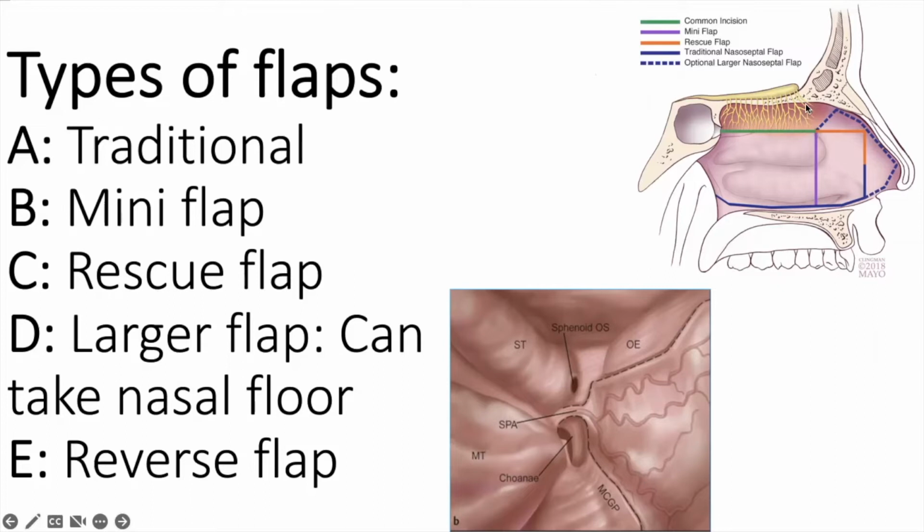And once these olfactory fibers end at the anterior limit of the middle turbinate, then your cut can go to the most superior portion, and then you make an anterior cut which is at the junction of the mucosa and the skin margin.